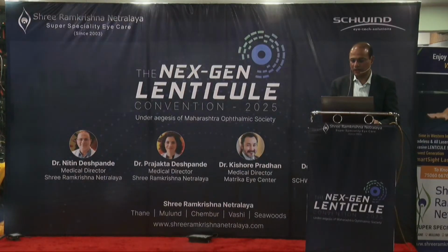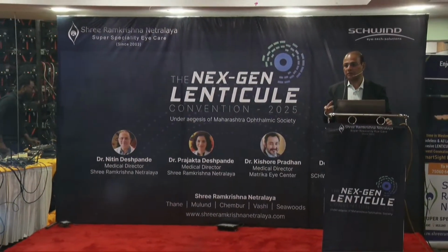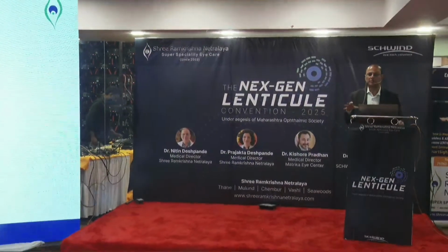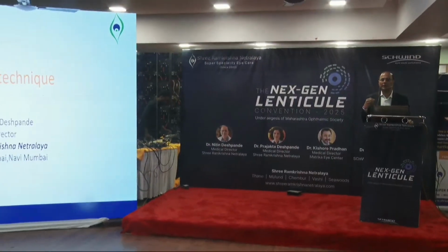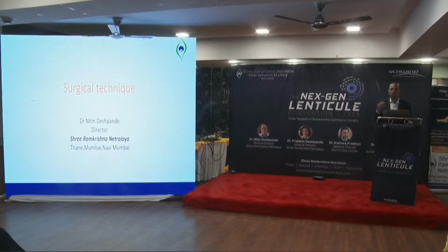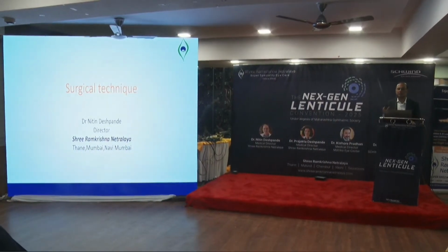In the next presentation, I'll also be sharing the struggle in the early stages, because as Dr. Prajakta pointed out, each place and each machine has different settings for energy. So it takes a few cases to really know what's best for your machine and your technique. So energy settings are very critical.